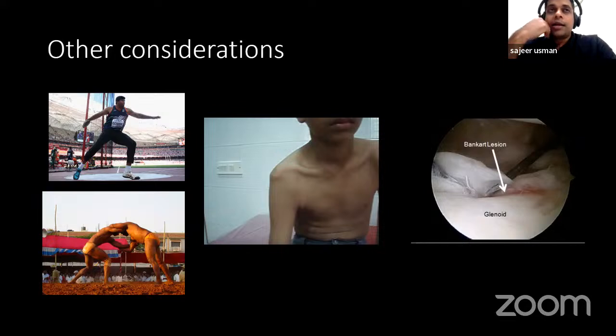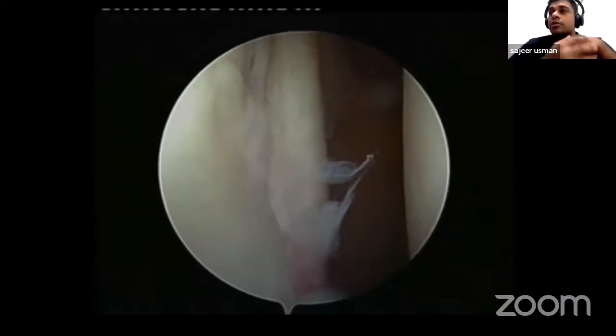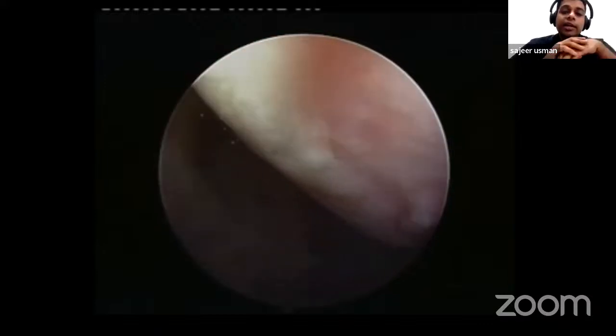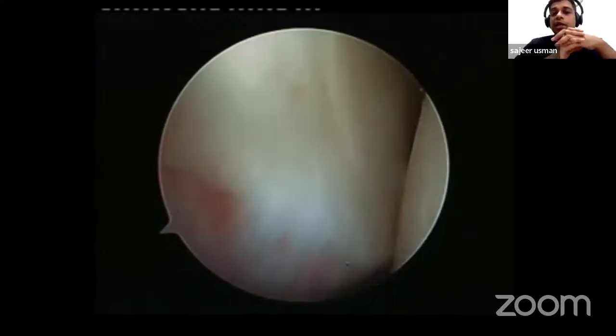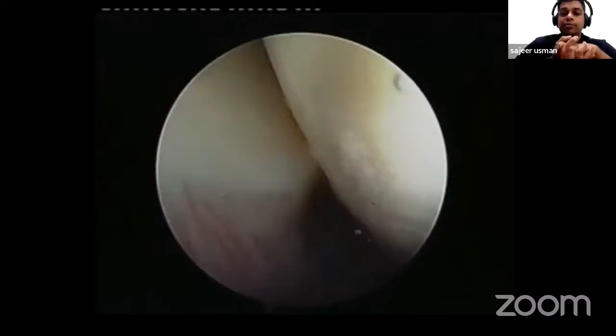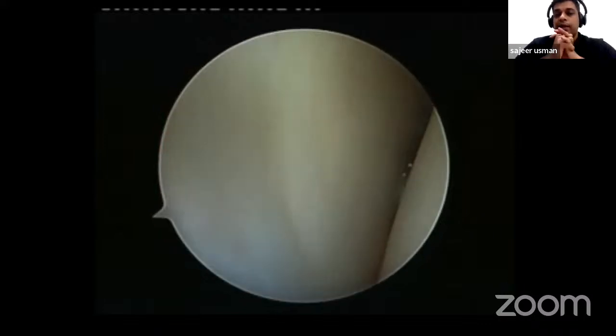while applying surgical procedures. And the quality of the Bankart tissue, that is the quality of the labrum tissue in itself, is something that we can understand only during a diagnostic arthroscopy. So a diagnostic scopy has a great value in finally deciding what procedure may work. Like here, you have a flat Hill-Sachs with a decent labrum, and this may be something where you can apply a soft tissue procedure only and get away without a Latarjet or Remplissage.